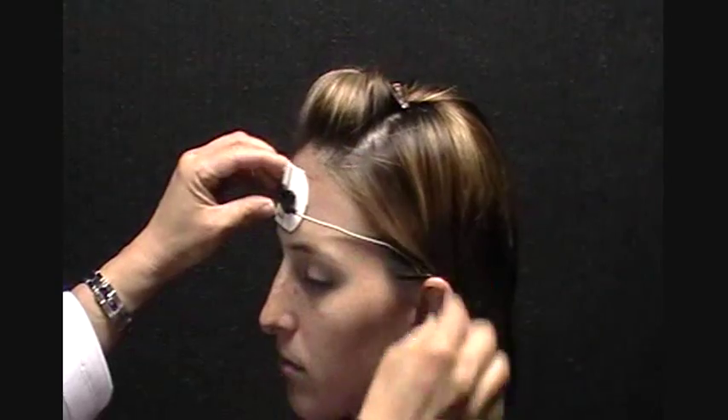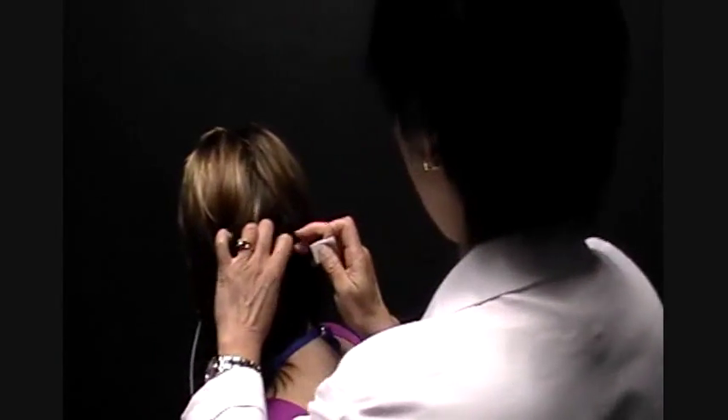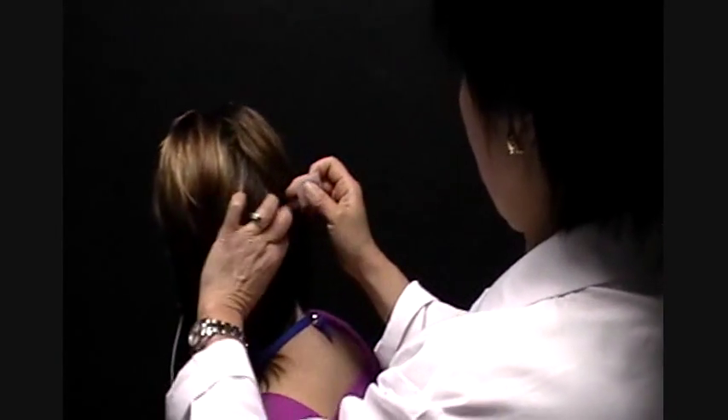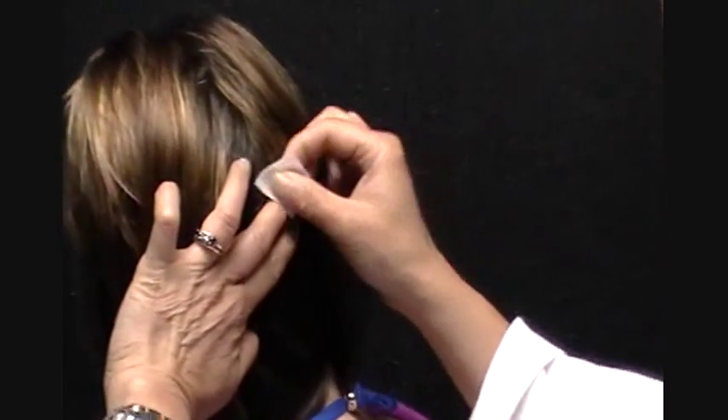We loop this around her ear for convenience. And the last is the testing recording electrode. Two finger-breadths above the inion — the inion is the protuberance of the occipital lobe.